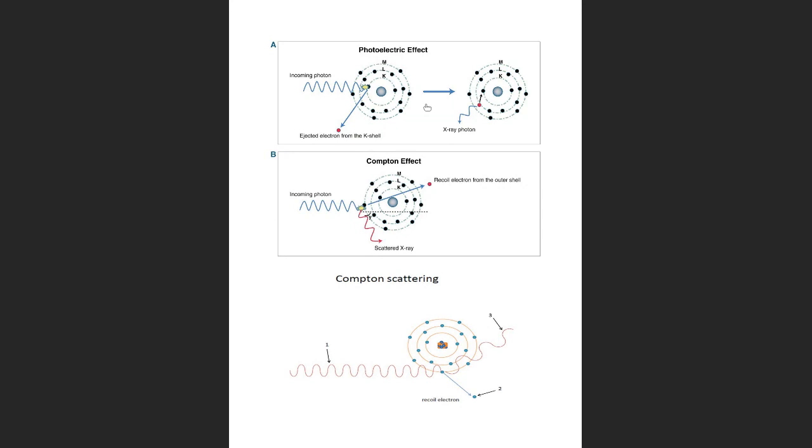What we're left with at the end of the day is we may be left with some Compton scattered photons. That's a negative, okay? That's not good. We would rather have no Compton coming out of the patient. But we do, and it can interact with the imaging plate. That's always going to be a negative.